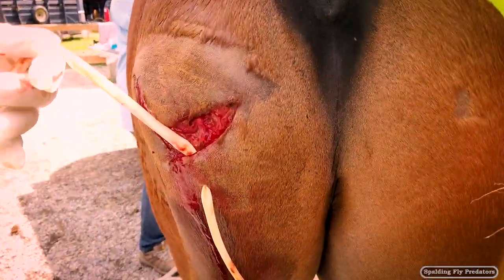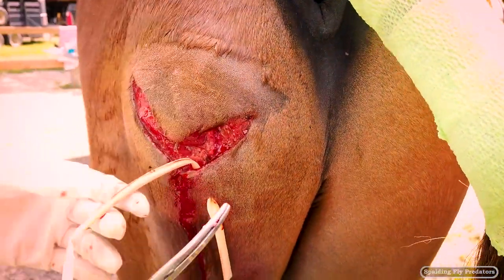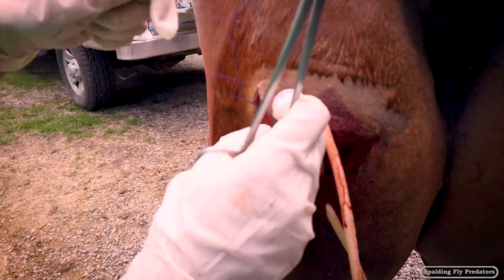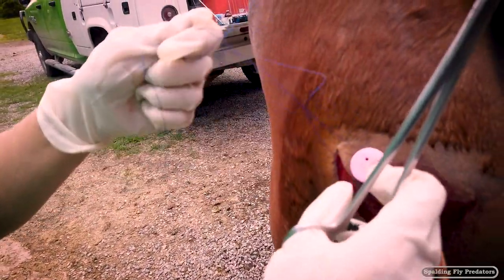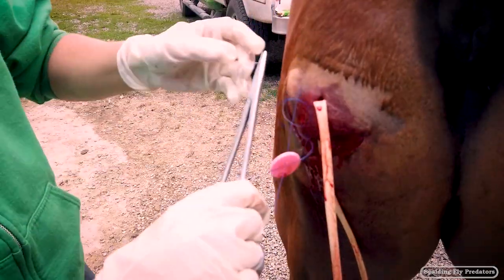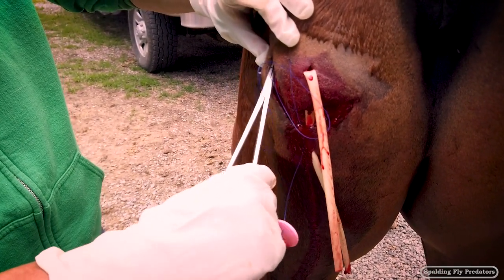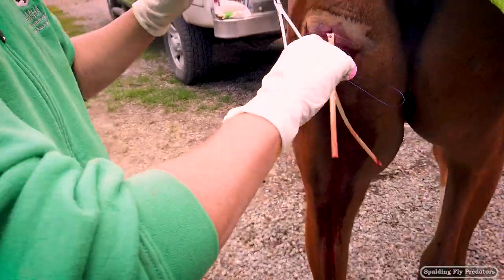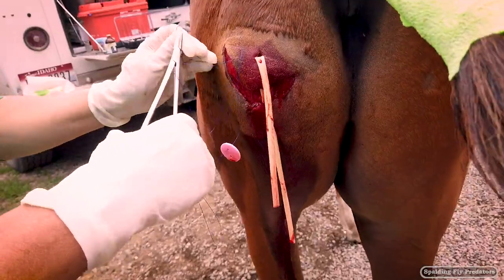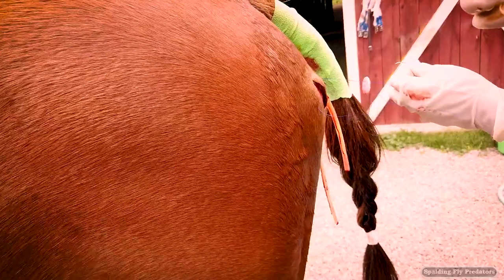Now we have the bottom of the drain placed and now we're going to attach it up at the top here. We're going to do a little attachment here too. We've got the drain put in, now we're going to use these buttons to put in tension-relieving sutures. We've got one placed on this side and we're going to place the other one over here on the opposite side. Good job, little man. Come on, buddy — quit walking.